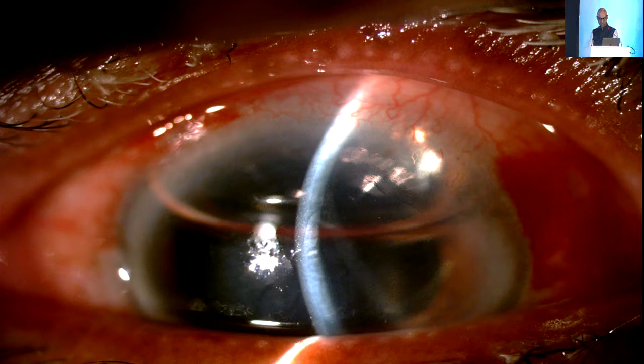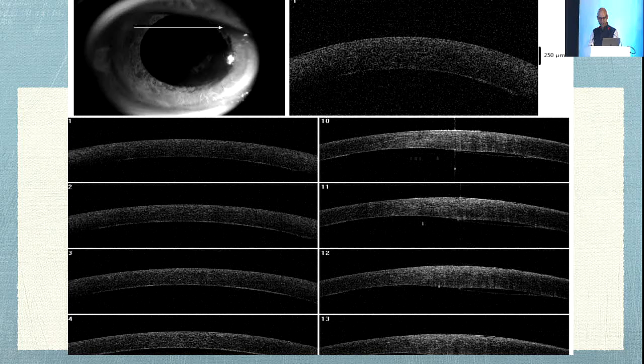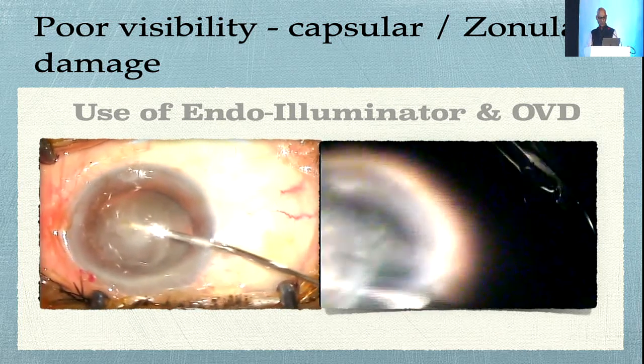And sure enough, there was edema after surgery, but the rest of the detached Descemet's attached. And over time, this cornea did clear up significantly and came to a vision of 6/9. And this patient actually did quite well.